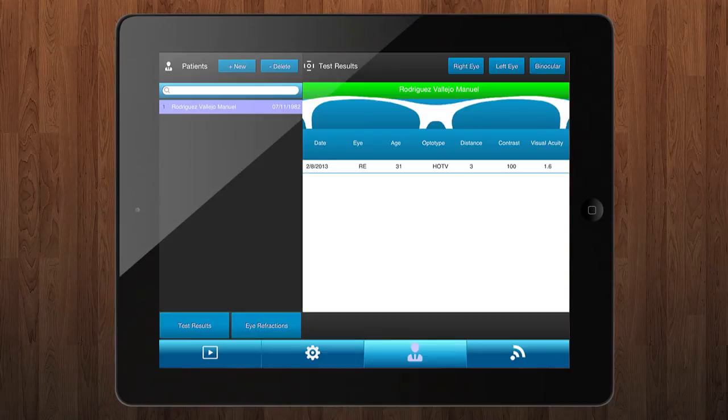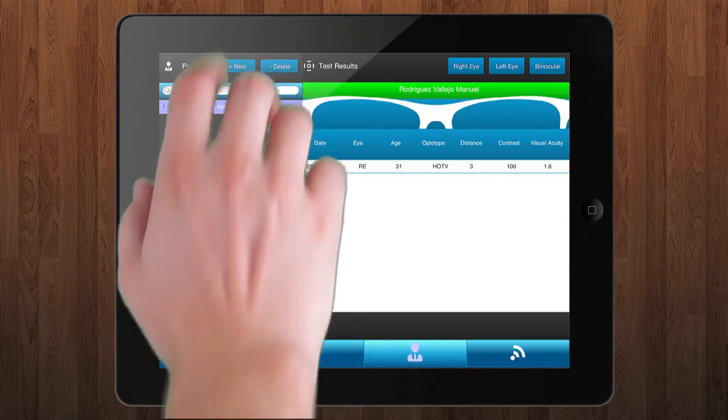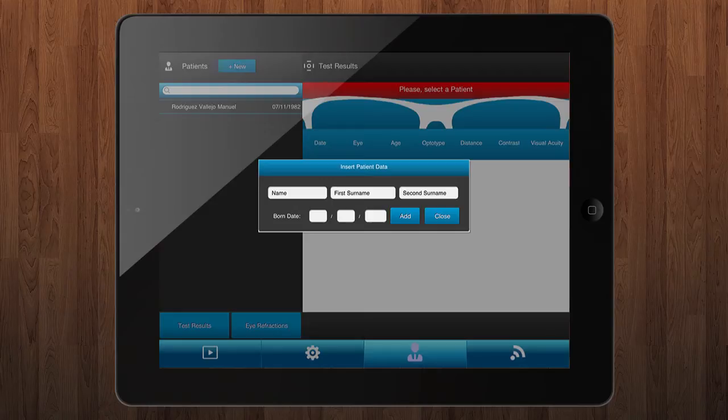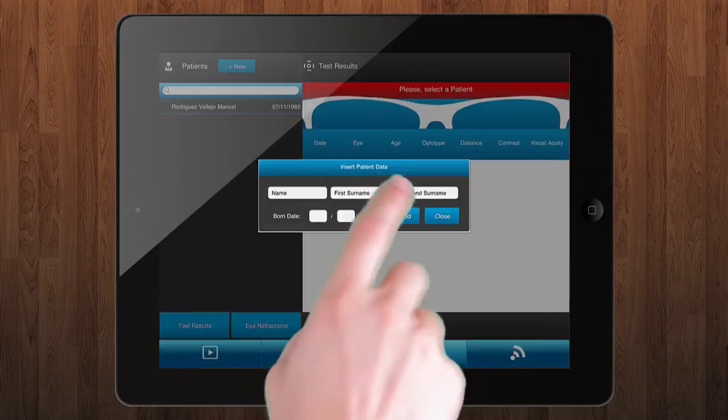To create a patient, press on new button over the patient list. Insert name, surnames, and the born date by this order: day, month, and year.